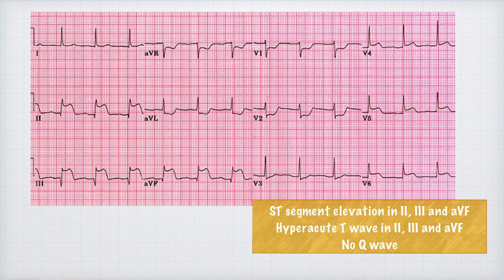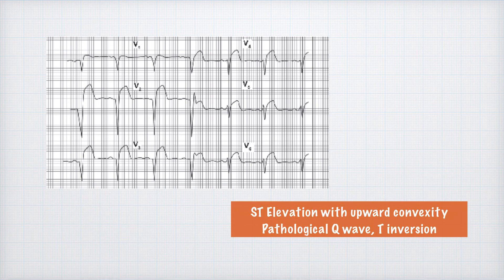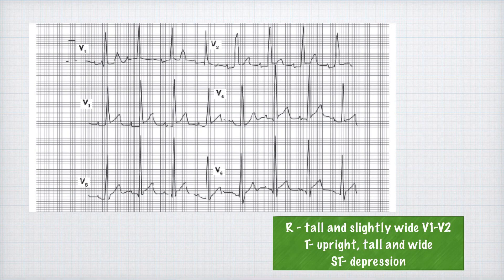Example ECG 3: ST elevation in leads II, III, and aVF with hyperacute T waves in the same leads and absent Q waves — this represents acute inferior MI. Example ECG 4: ST elevation with upward convexity in leads V1 to V6, pathological Q waves, and T wave inversion — this is acute extensive anterior MI. Example ECG 5: tall and slightly wide R waves in V1 to V2, upright tall and wide T waves in V1 to V2, and ST depression — this is true posterior MI.